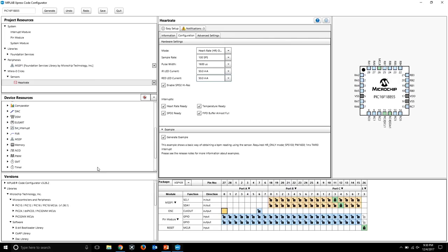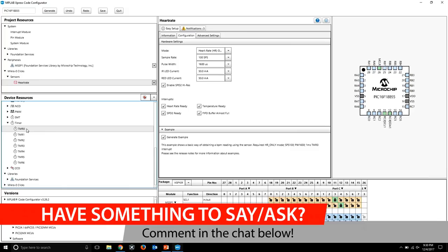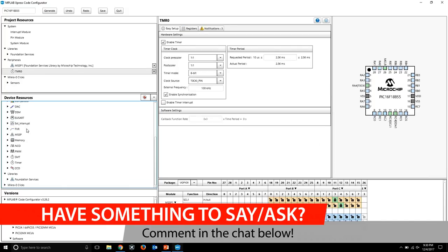So the easy thing to do is go to device resources, and that's where we know what we have in this board. So I'm just going to go to device resources and see, oh, there is a timer. And on the timer, we have timer 0 through timer 6. So we have all the timers in this device. And I'm just going to click on timer 0. That's what they want us to do on the example code. So I'm just going to double click on timer 0.